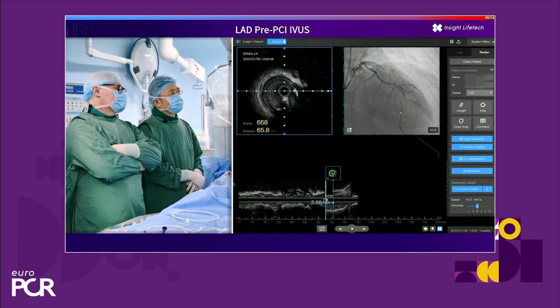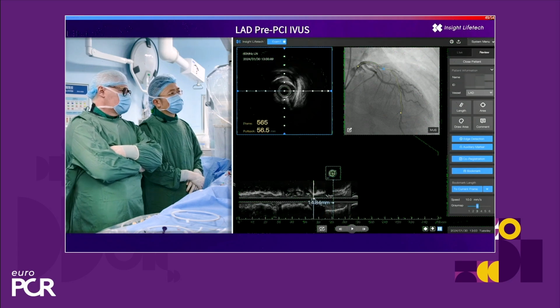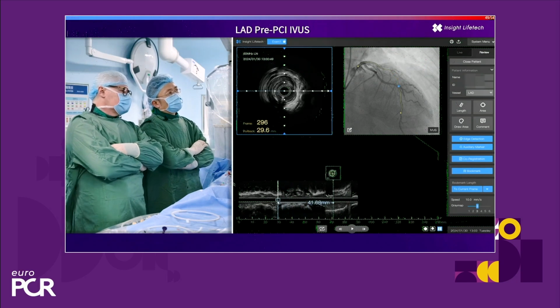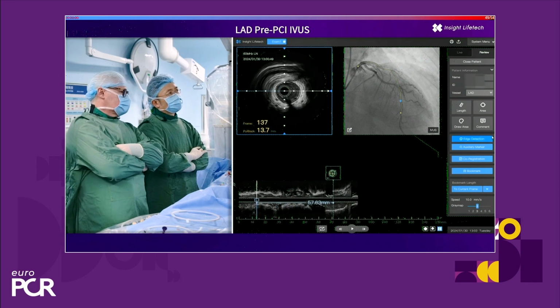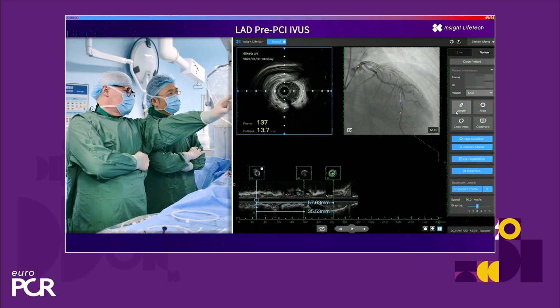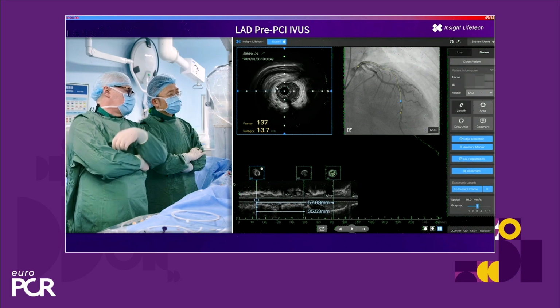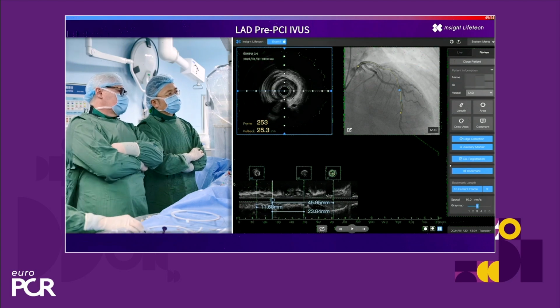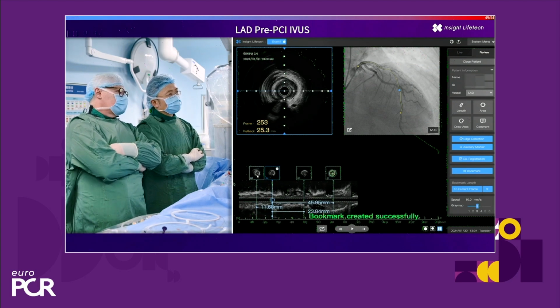So first of all, probably it would be very difficult to treat it with only 1 very long stent. We need 2 stents, which is also better because we have 2 bifurcations. So first we can treat with a long 2.5 stent across the second diagonal, do the POT, and then use another overlapping stent in the proximal part. What do you think? Yes.